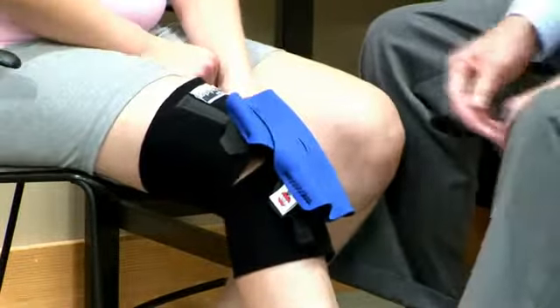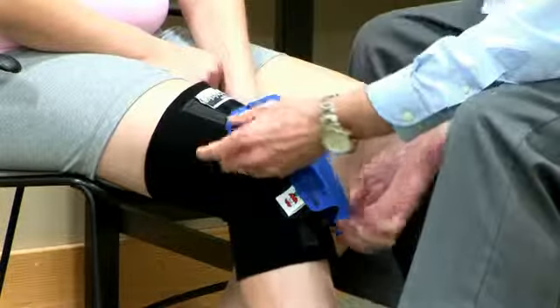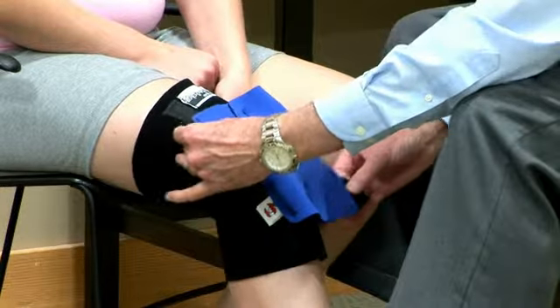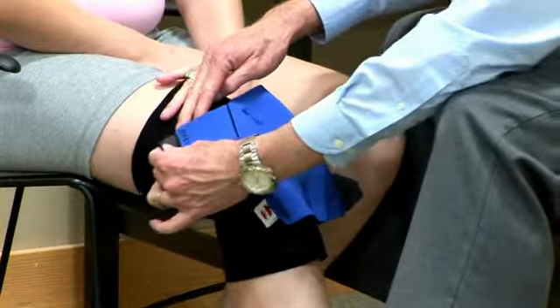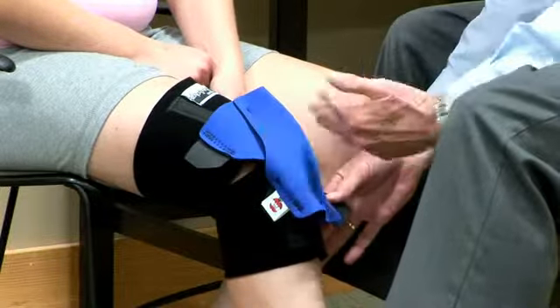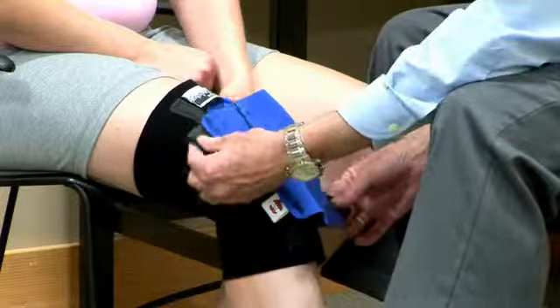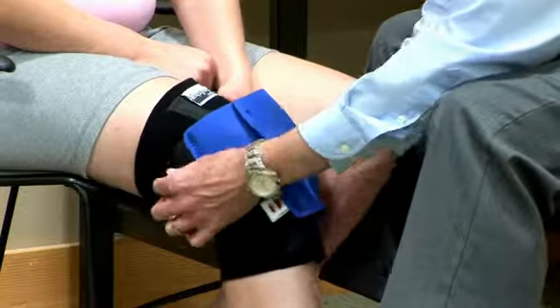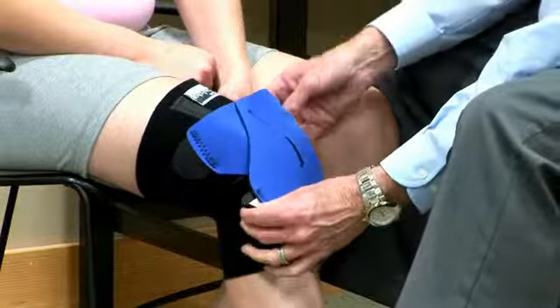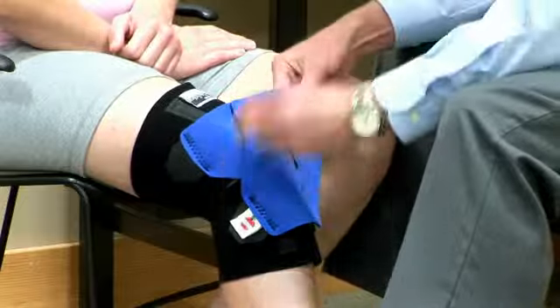Now we can position the patella. We take the lateral tab and the medial tab and simply stretch them out. By pulling the lateral tab a little more, we move the patella laterally; pulling the medial tab more moves the patella medially. Depending on the maltracking posture, we can correct it by adjusting that tension. This does not need to be super tight — just a little traction on the patella to help it move better in its track.